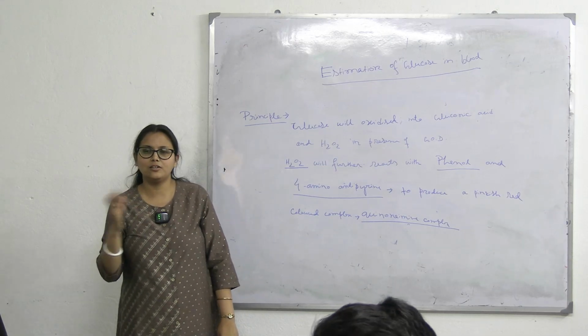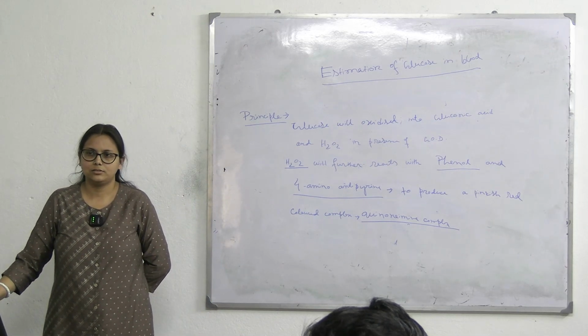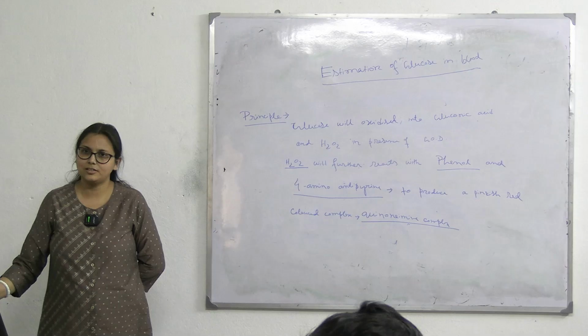Is there any relation with the concentration of product and intensity of color? What relation is there? Concentration of glucose and concentration of red color. Any relation?